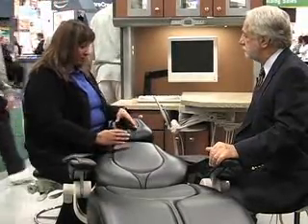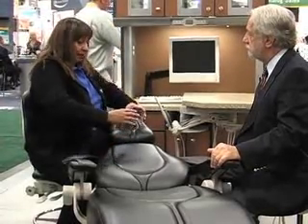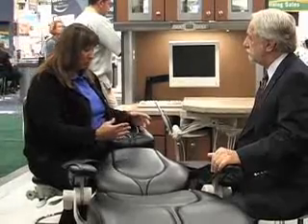And if you'll notice, my arms are very comfortably by my side, and I'm not having to lean, I'm not having to reach my arms, which is what's causing the majority of the health issues in dentistry today.